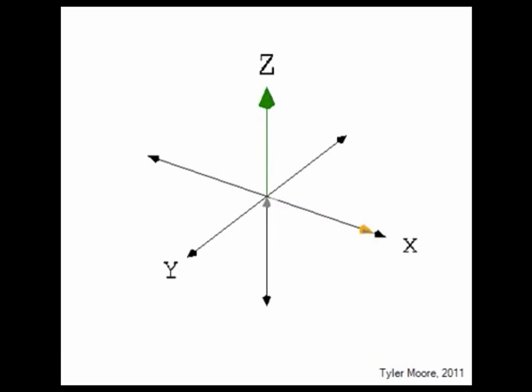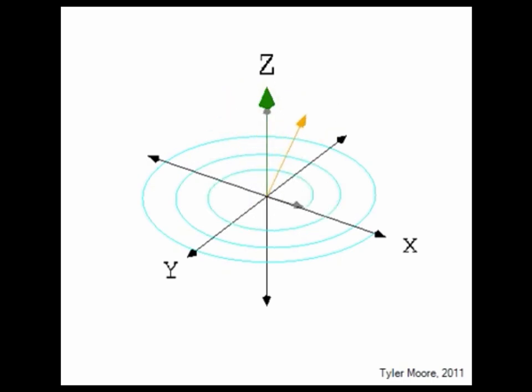And what happens is the population along the Z-axis, you can see here, it should regrow as time evolves. Just the one unfortunate thing about this particular animation, it shows the T2 decay here as well, horizontally. That's independent of T1. But the main idea is to see how this component is regrowing. So that's the important part about T1.